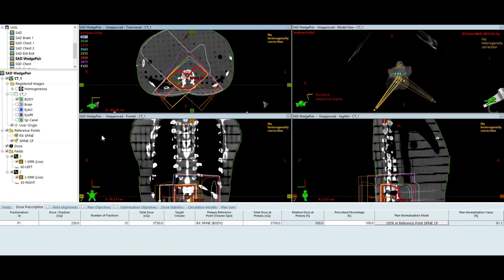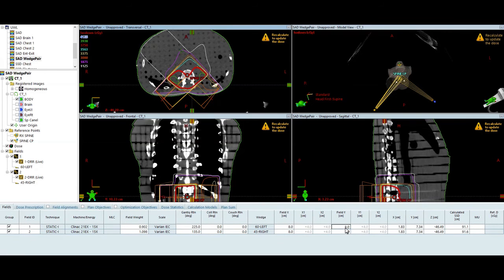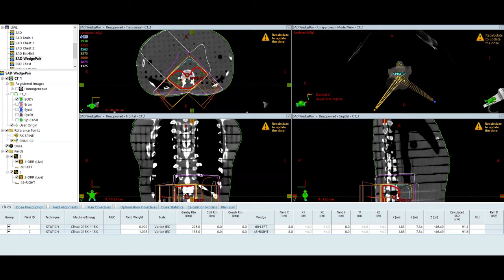Now, I am going to calculate the monitor units. So in this, I need to know what my relative weighting for my calc point is, and then we're going to look up some wedge factors as well. I have an 8x8 field size. Let me recalculate this, 8, 8. We'll make them the same, and we'll just avoid the equivalent square field calculation, and we'll just look everything up for an 8x8 field size.